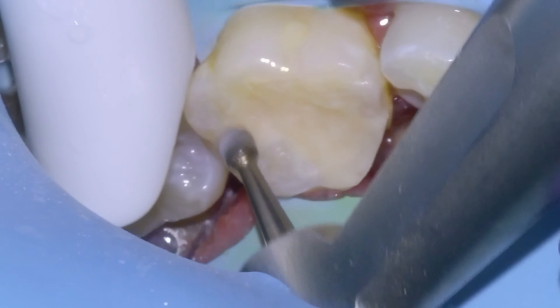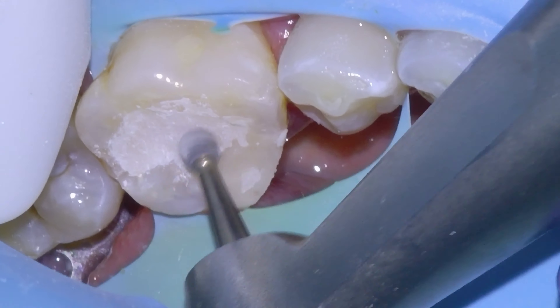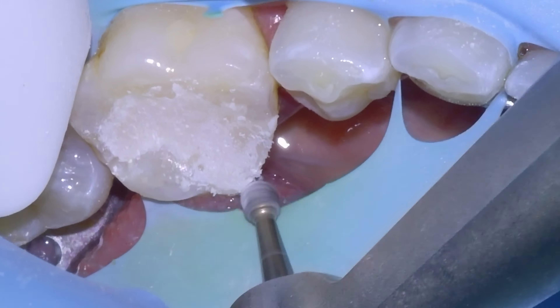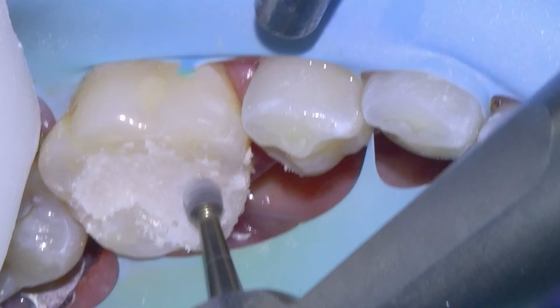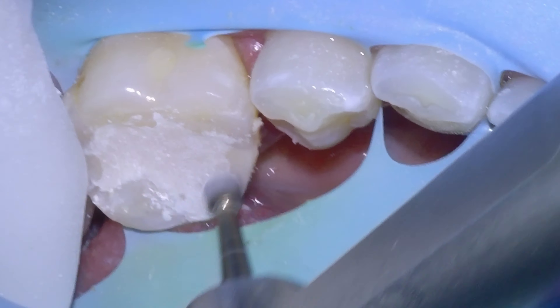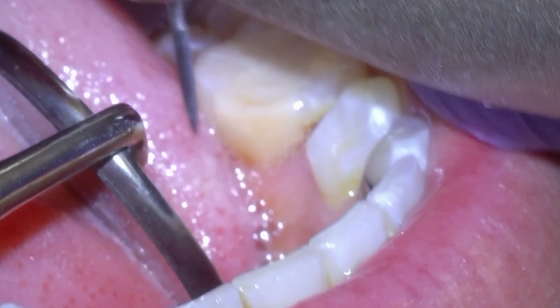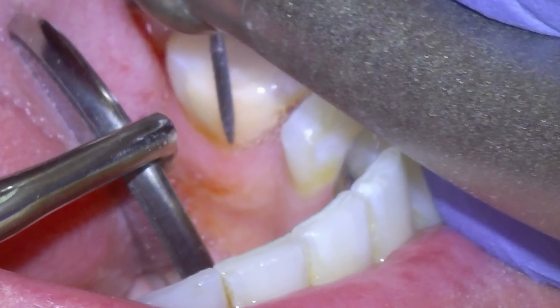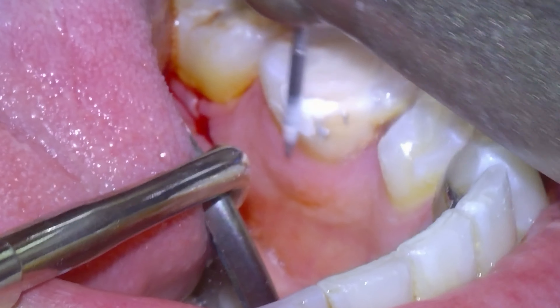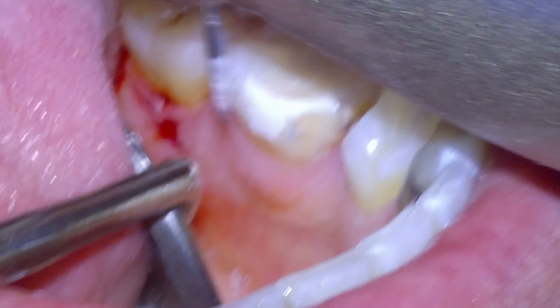We've got most of it away, and now we're going to use a carbide bur to do our refining touches. This material is so easy to adjust because when it's dry you can clearly see the margins. We're going to smooth off that corner of the cusp that we replaced, take off the rubber dam, and then smooth off the tongue-side surface of the tooth so that it's flush, using a carbide flame bur — and then round off that corner there as well.